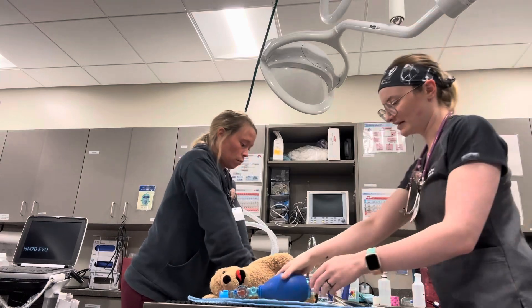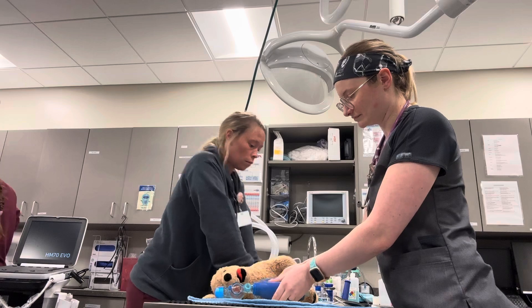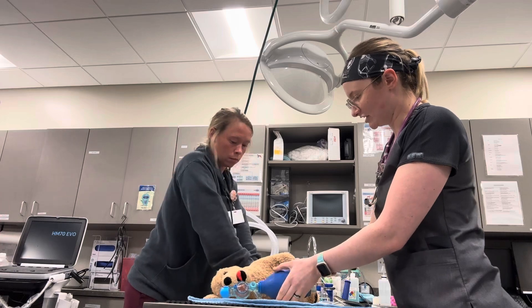We have our ambu bag here connected to our endotracheal tube. Every 6 seconds — confirm placement by seeing chest wall rise.